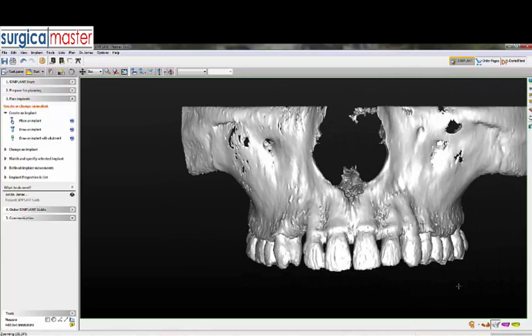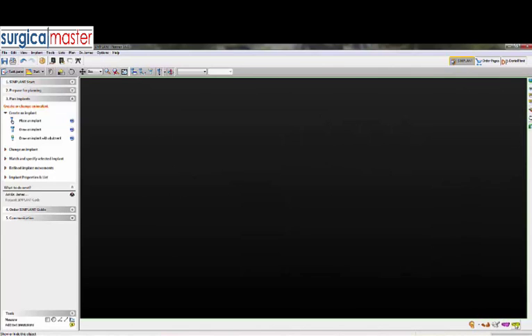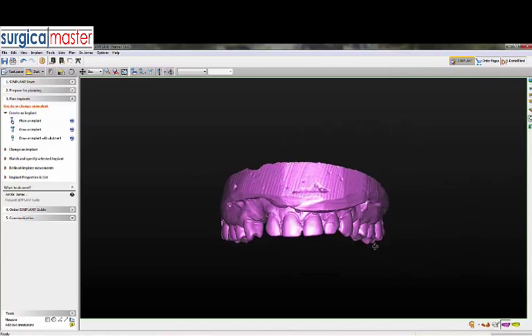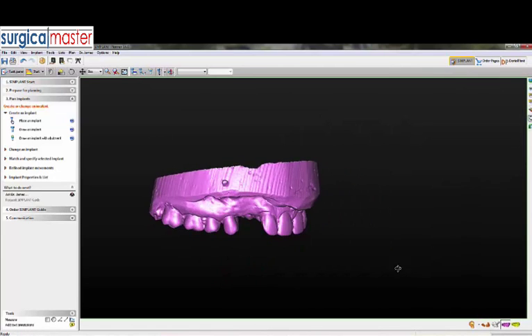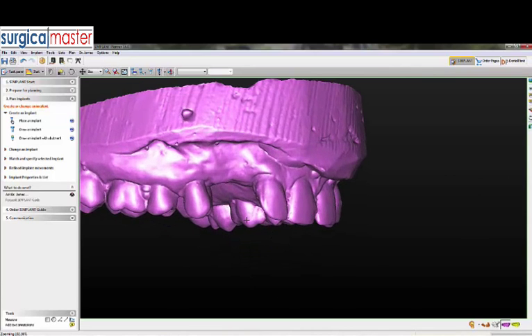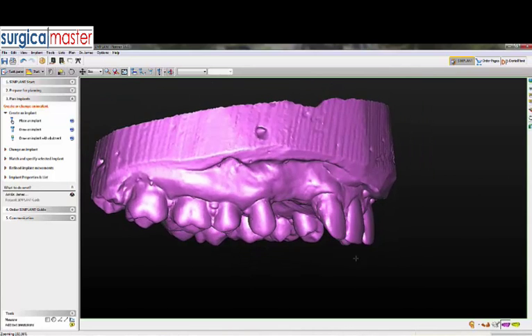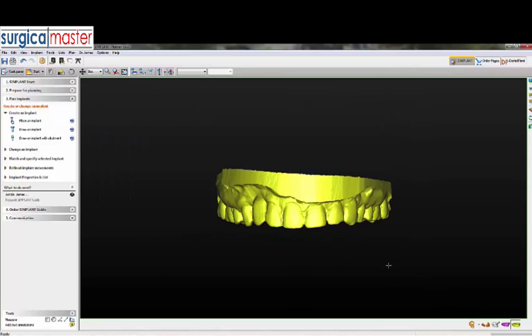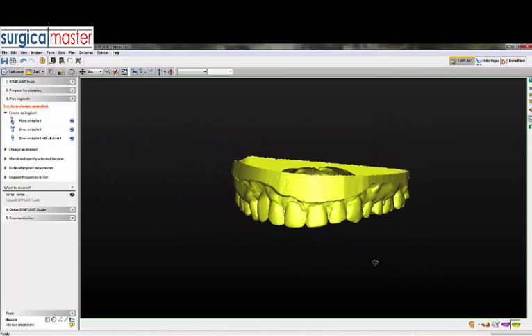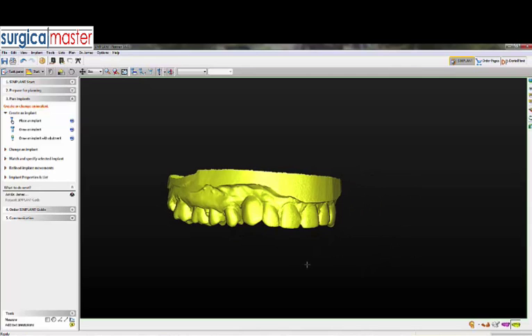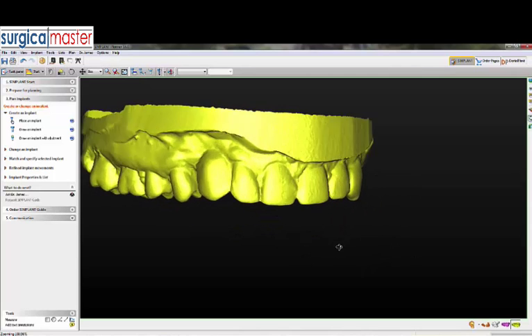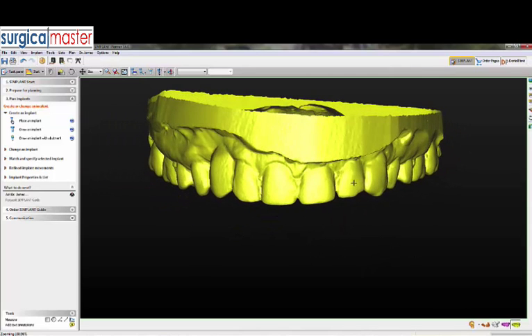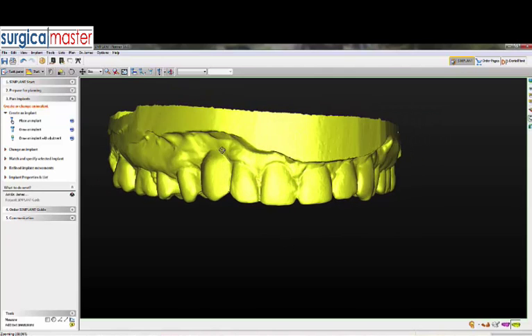I also imported the edentulous site here in pink. You can see the mesiodistal space that is increased — in this area it's going to be a restorative challenge, we see some spacing. I also imported a wax-up of the canine, and you can see the asymmetry between the two canines because we had some bone and tissue loss in this area.